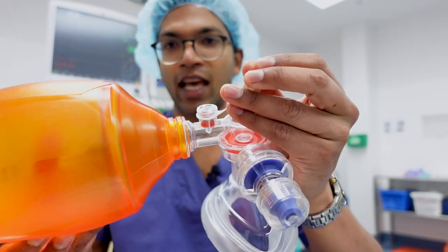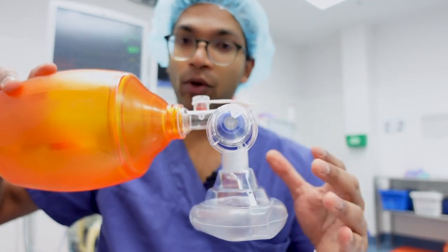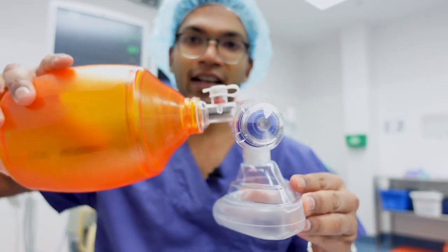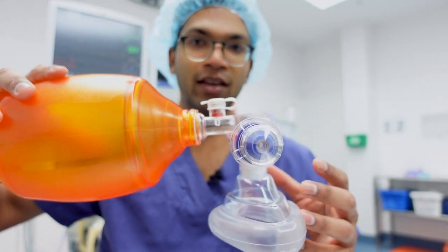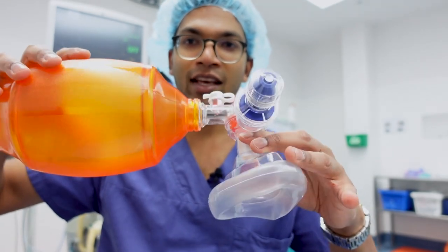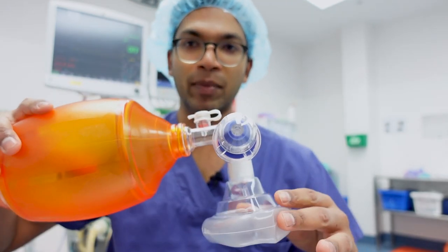It's really important that with these devices you're attuned to what's happening with the patient. For example, if this cap was off and I start ventilating — if I realize there's no rise and fall of the chest, no fogging of the mask, or no end tidal CO2 — that means I'm probably not ventilating the patient. So I'd put the cap on to make sure I've got higher pressure and start ventilating. Once I've got rise and fall of the chest I know the patient's safe, and if I feel too high a pressure — maybe the patient's gas trapping and overfilling with oxygen — I just use the mask as a valve to let air out.